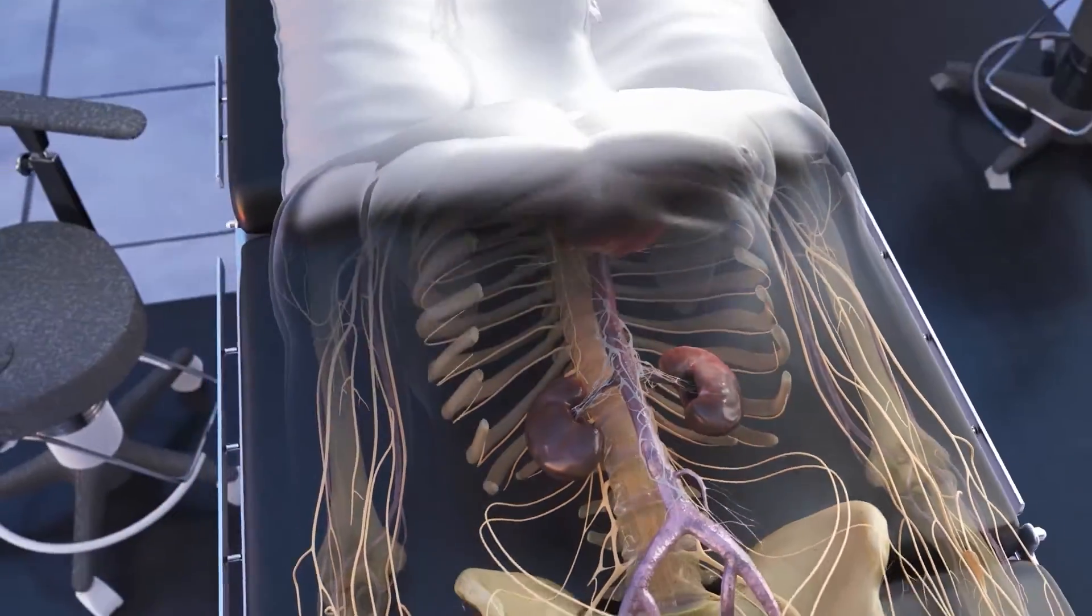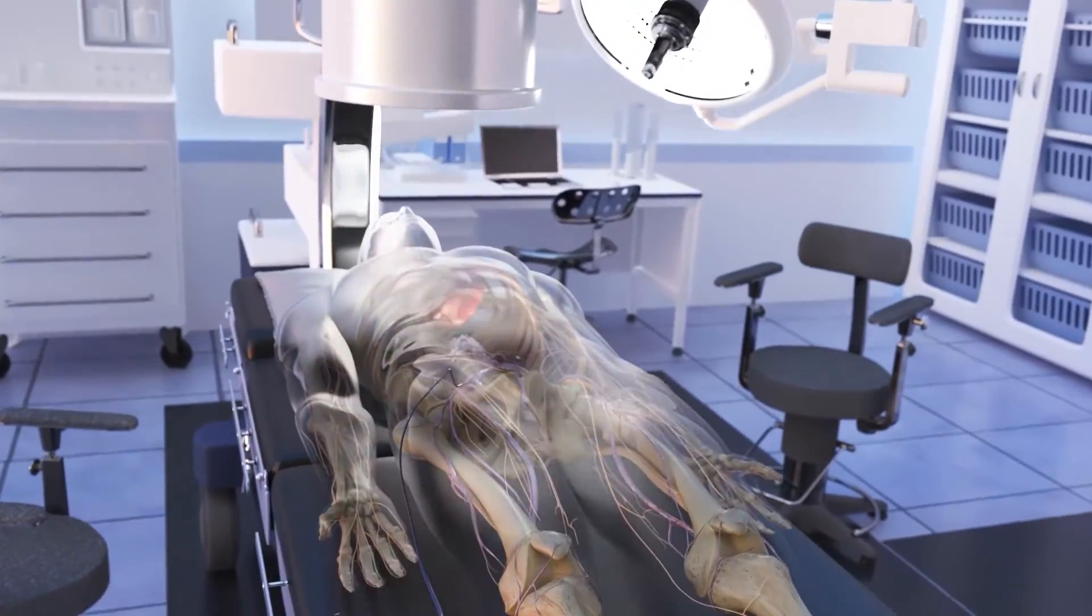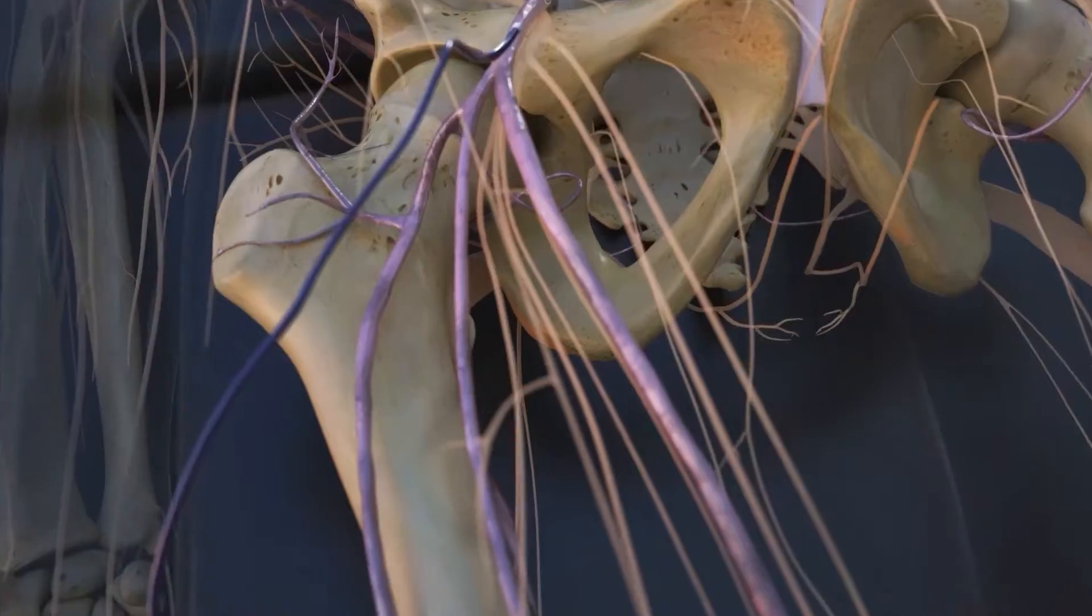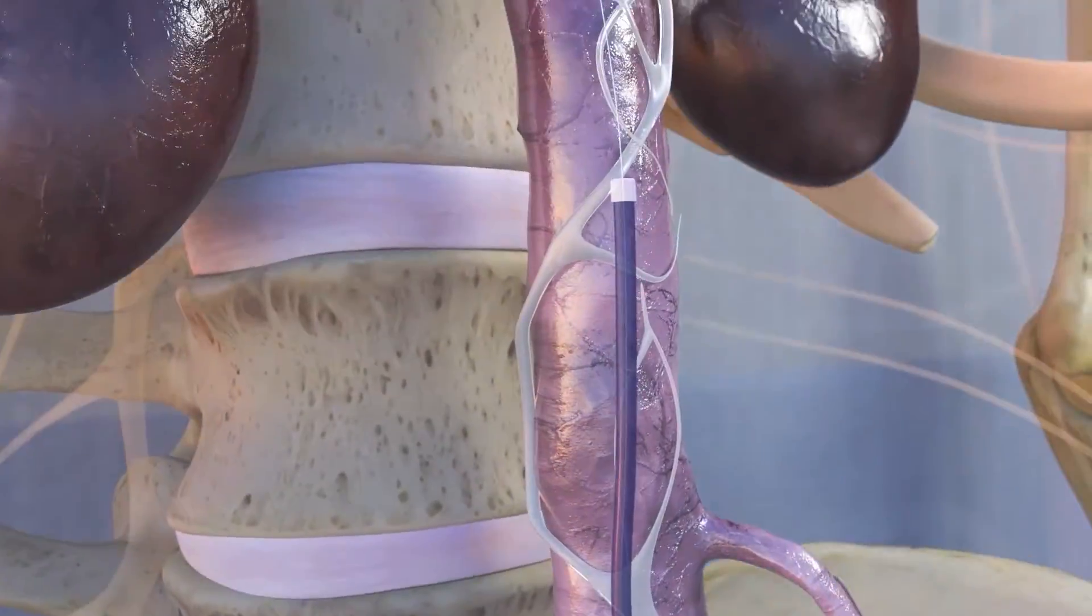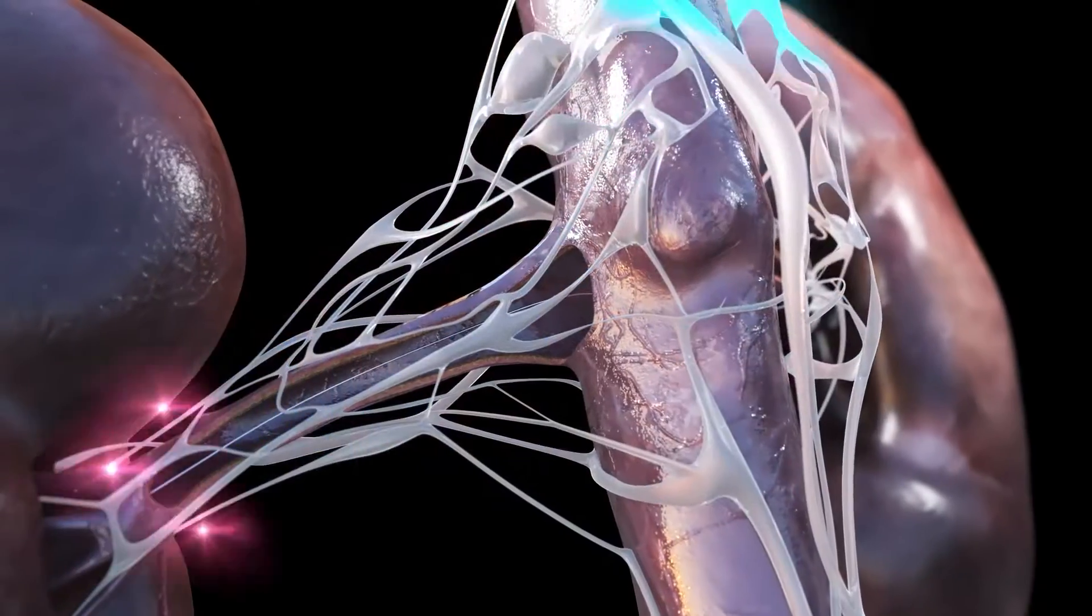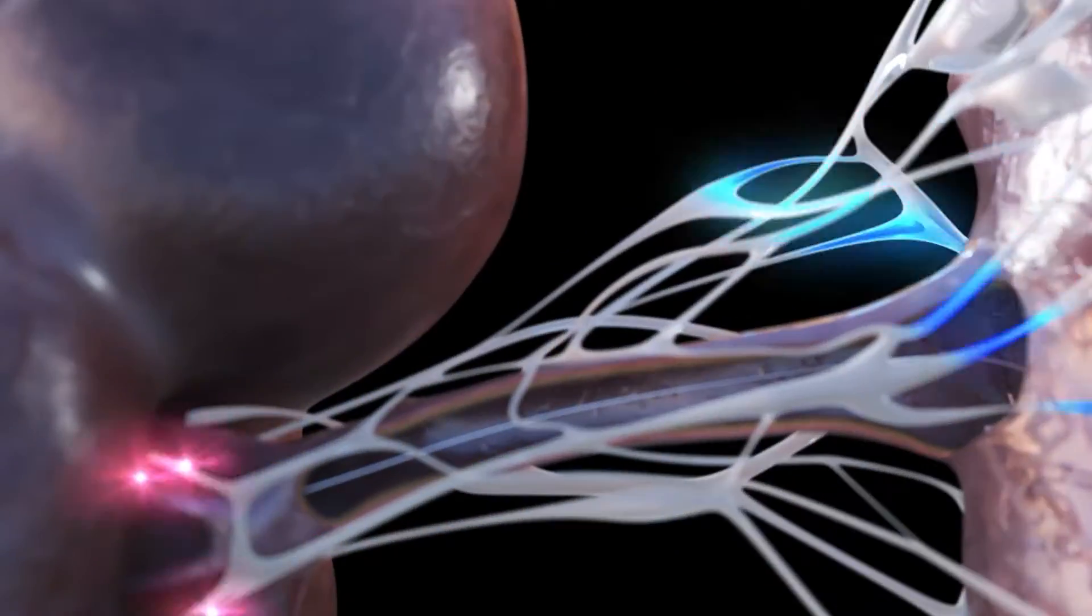Typically performed in a catheterization lab, the Paradise procedure begins with access to the aorta through the femoral artery. The procedure is performed in the main renal arteries where there is a high concentration of nerves just outside of the arterial wall.